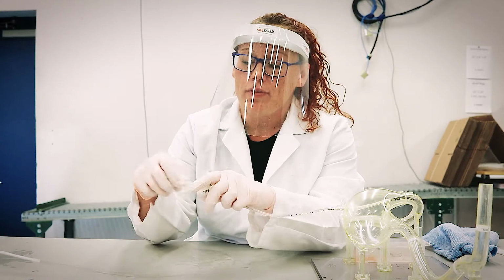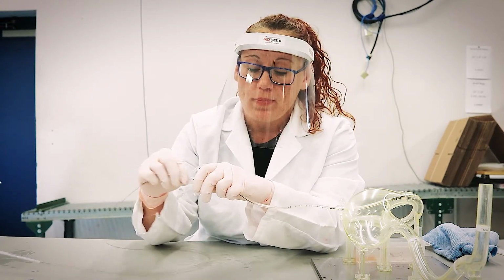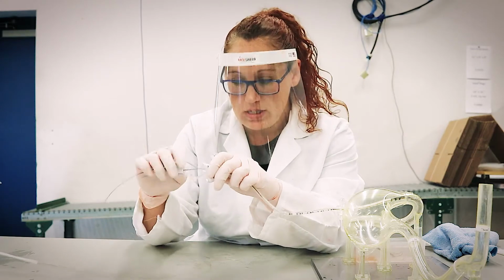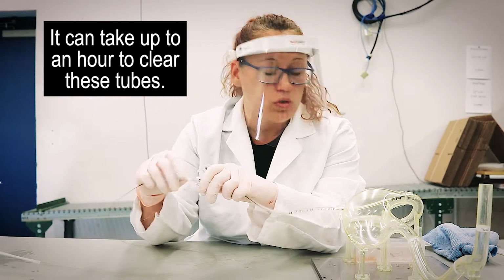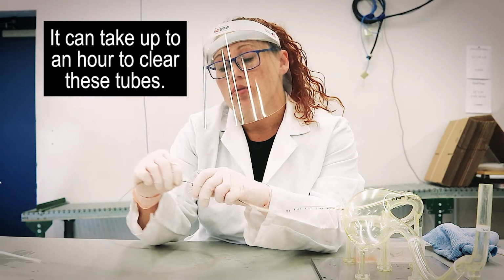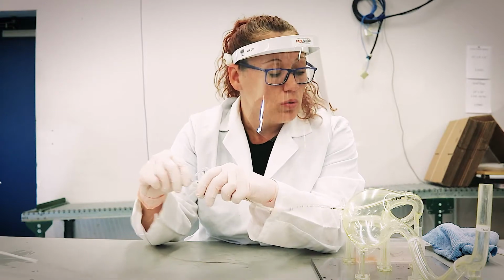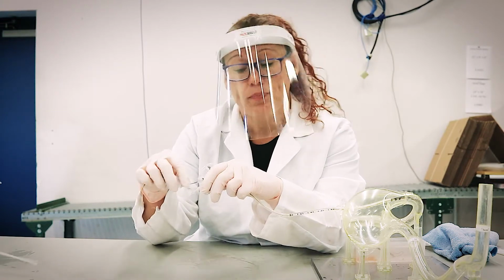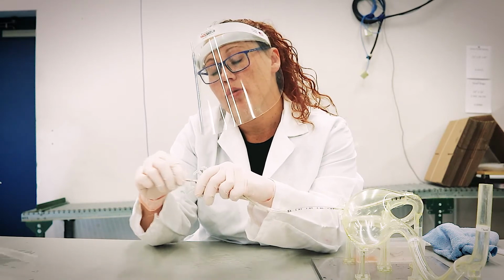A lot of our effort is lost in this motion of this neck. Now that I'm close to the bottom, you can see that I'm getting my depth limiter. It was a long process, even though the tube had flushed out and cleared. So don't get discouraged. Don't think that you're doing something wrong. These tubes tend to just be a little difficult to get through, but not impossible and totally worth it.